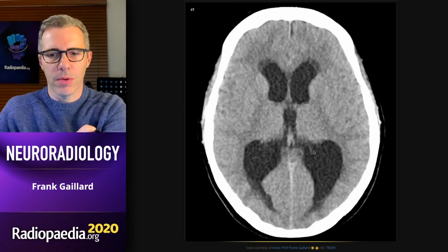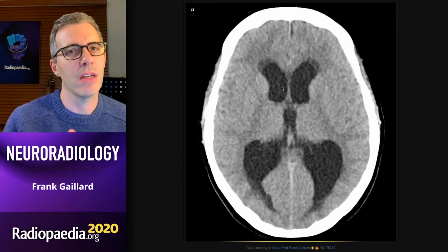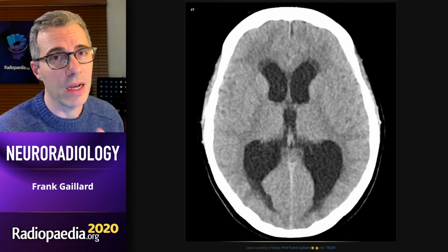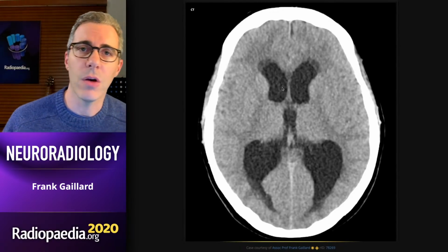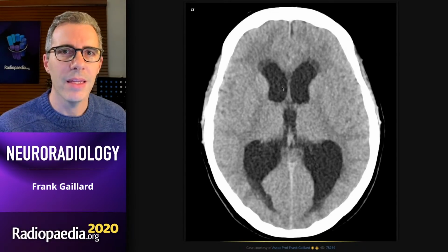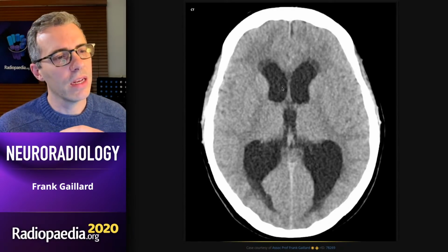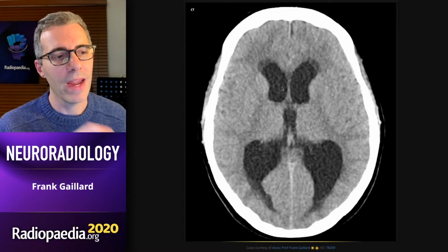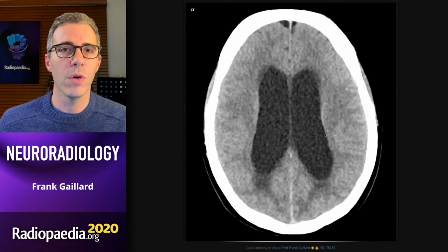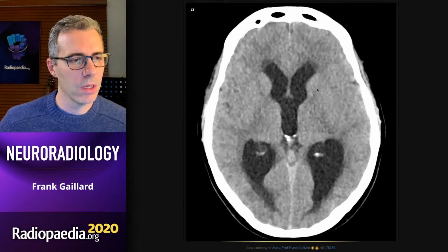Well, problem solved. We can see why they have headaches. She's only 25 and has these massive ventricles. By the time you get ventricles of this size, you know they've had hydrocephalus for some time. You don't know how long, but it's not today, because if a 25-year-old was perfectly normal yesterday and then suddenly obstructed their ventricles, say from a colloid cyst, then they would be obtunded way before their ventricles got this big. But you also know that there is ongoing acute obstruction here because you have extensive transependymal edema. We can follow it down.